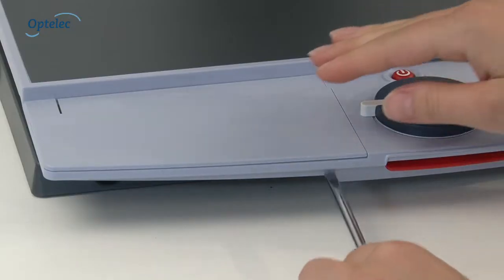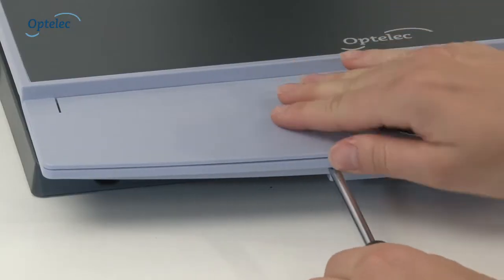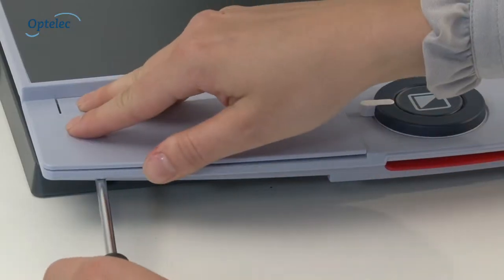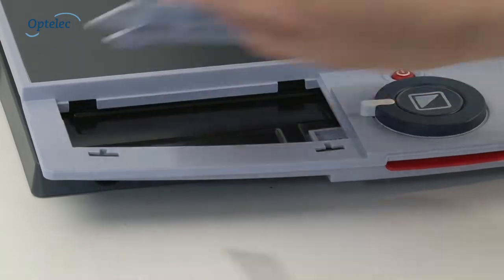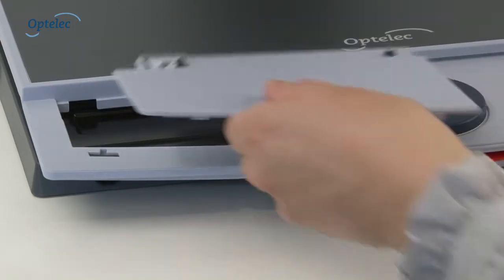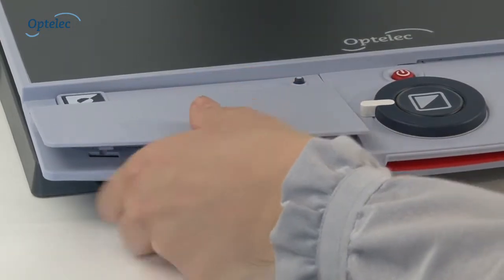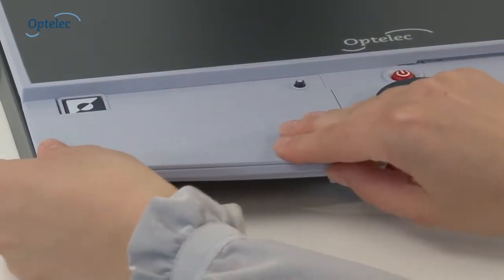Add additional functionality to your Optelec Clearview Plus desktop electronic video magnifier. With a basic feature pack installed, you can locate your position within a document easily.